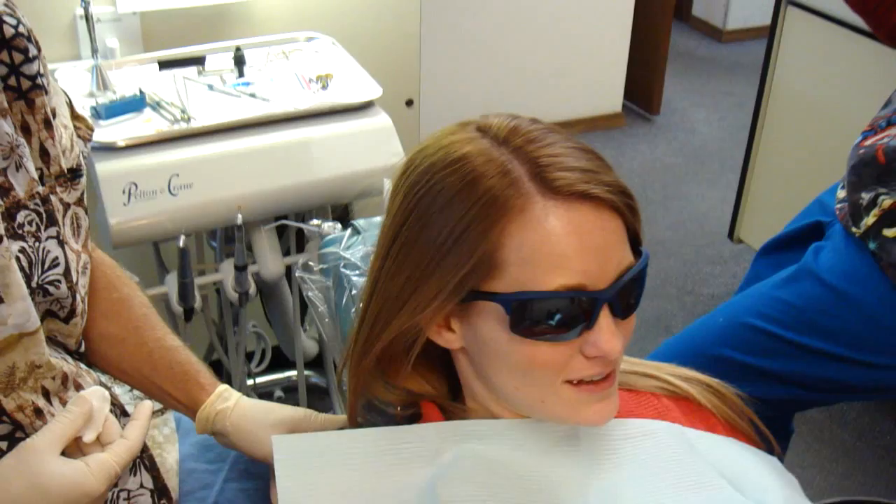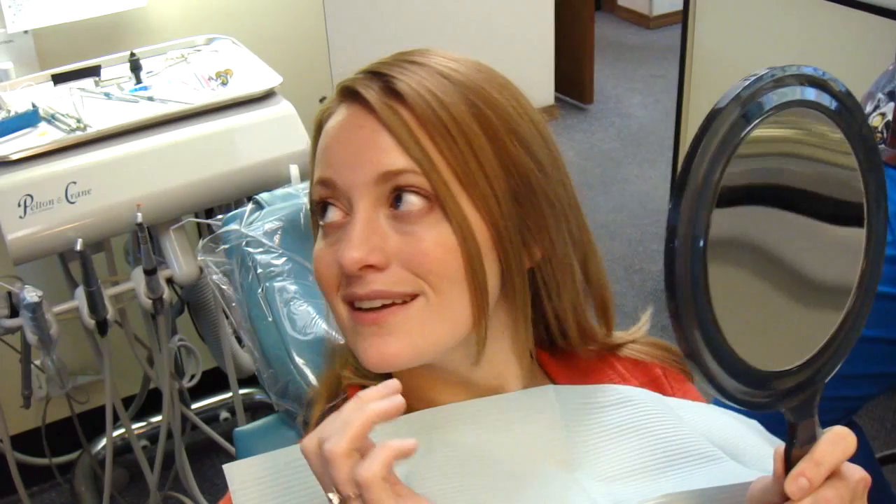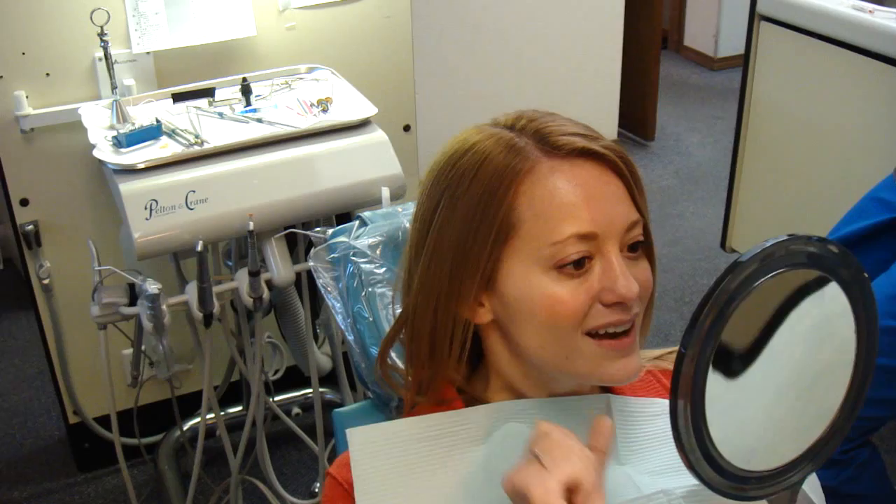I'm going to sit you up. You can't really talk too much — you can speak, but be careful because they're just sitting there. Take your glasses off so you can see. Oh my gosh. That looks awesome. Like everything about it? Not too long, not too short — everything.